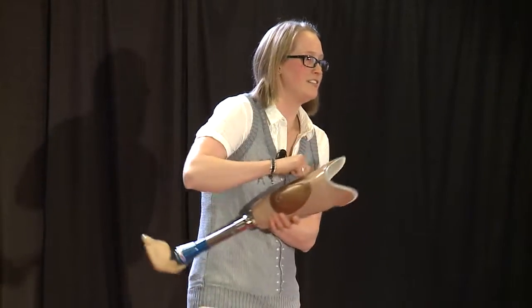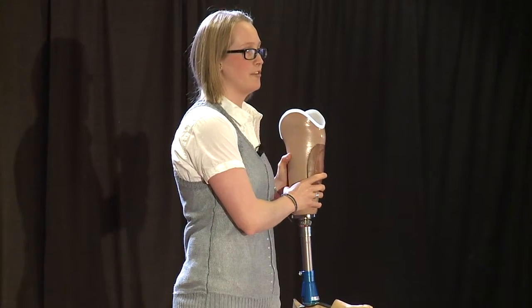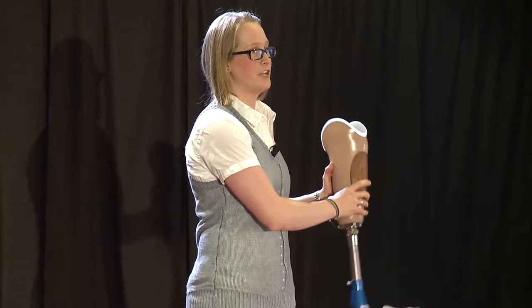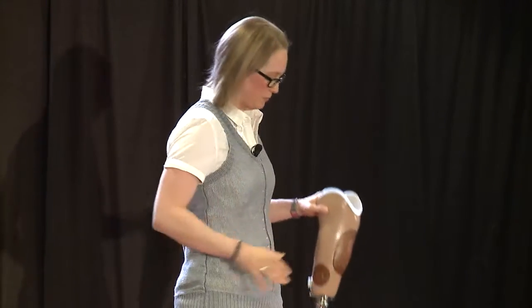As you can tell, the socket is a rigid shell, and it needs to be rigid so that it can support the full weight of the patient, and so that it can allow for a more natural gait when walking. If the socket weren't rigid, it would be really difficult to stabilize yourself when you're trying to walk.